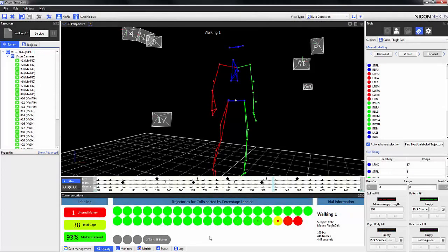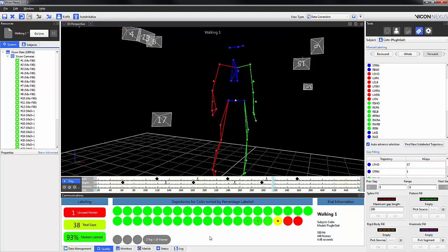The grey circles indicate trajectories that are unlabeled. The color of the trajectory indicates the percentage of the marker that is in the trial. Green indicates that the marker is in the majority of the trial. Red indicates that the marker is predominantly missing and yellow is somewhere in between. Essentially, the lighter the circle, the healthier the trajectory and vice versa.